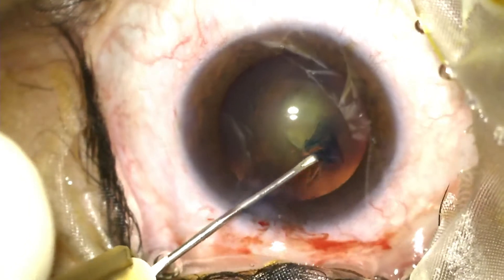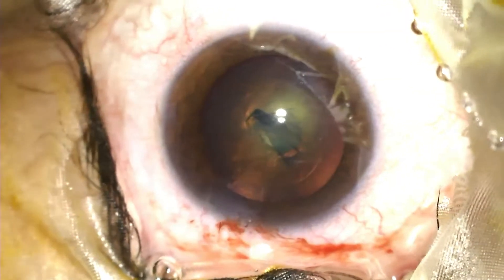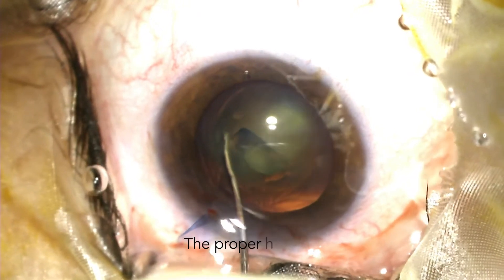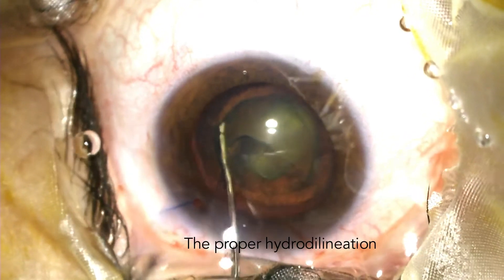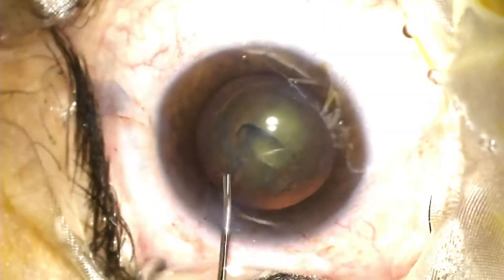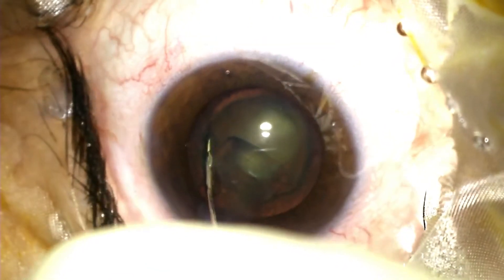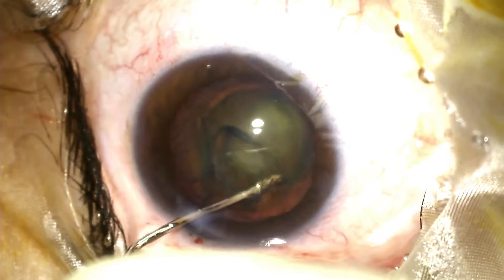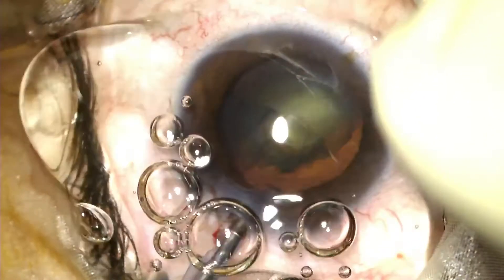What you will now see me do is bury the hydrodissection cannula to a pre-desired depth and inject a jet of fluid to create a hydrodelineation. What the hydrodelineation does is demarcate the endonucleus that needs to be downsized and emulsified.